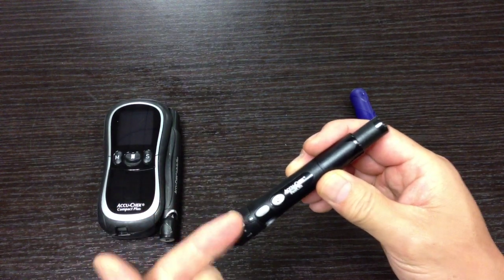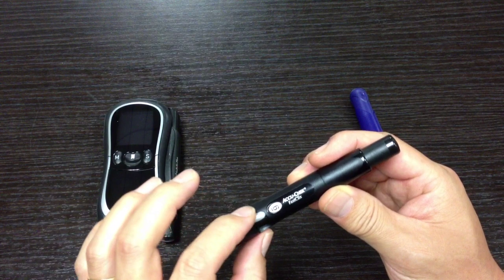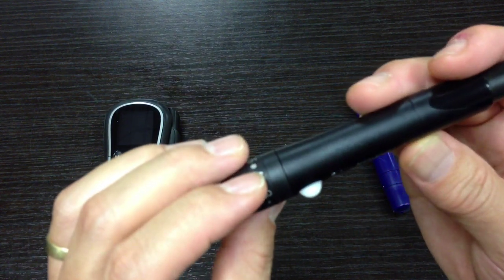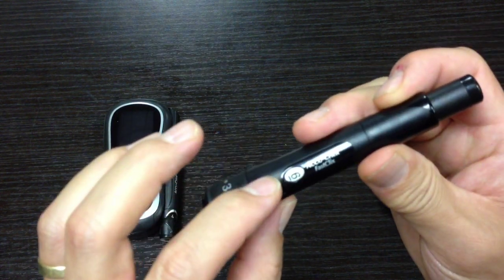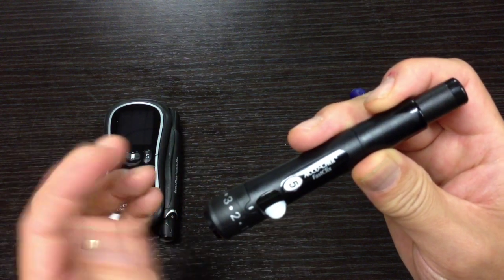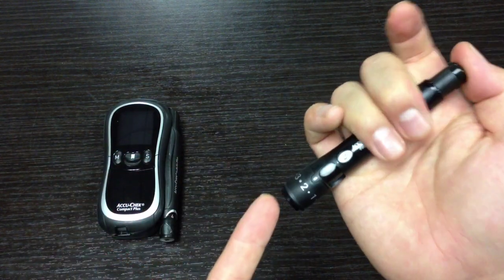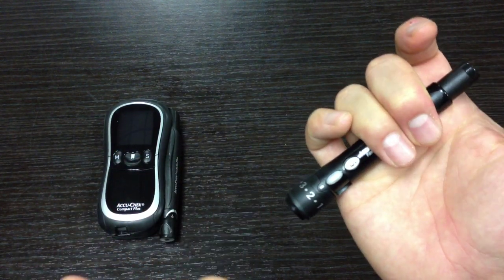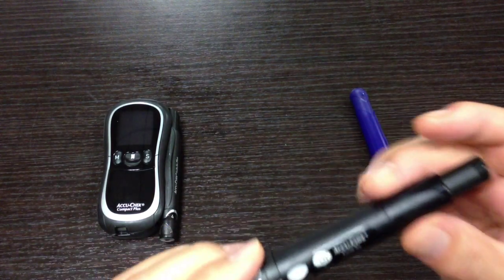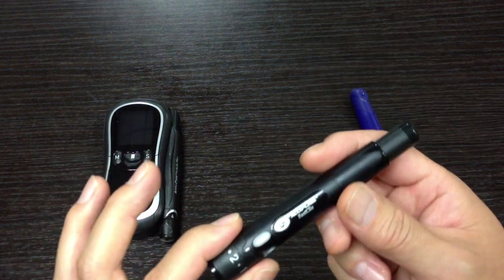And when you want to go to the next lancet, it's a lot easier too. See this little lever there? If you pull down on it, it goes to the next lancet. Then you go ahead and press down and that's it. They made it so much easier and I love it — it just seems a lot smoother.